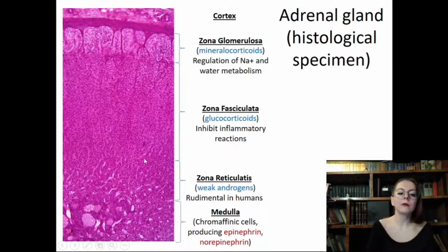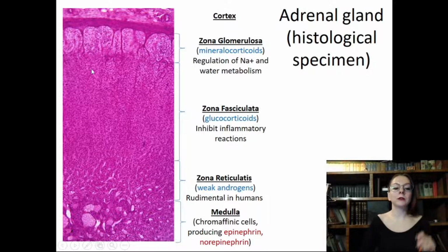Okay. So those two zones are actively stained with special dyes like Sudan. Sudan stains lipids. So this zone is rich in lipid droplets. And what is interesting is that cells from the zona glomerulosa are converted into the zona fasciculata. So the zona fasciculata is formed by transdifferentiation of the zona glomerulosa.